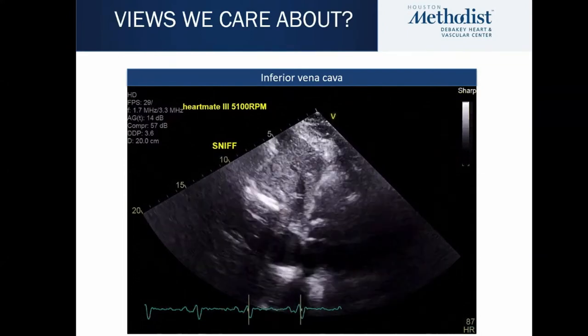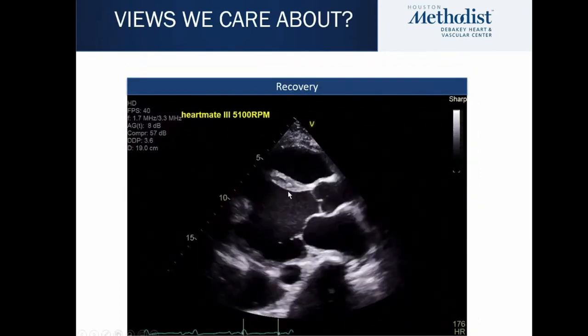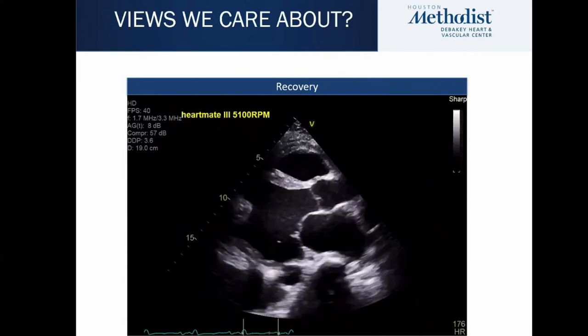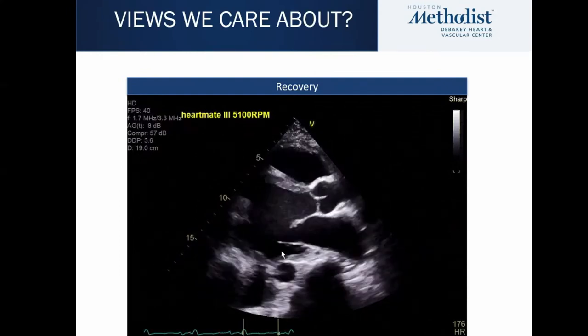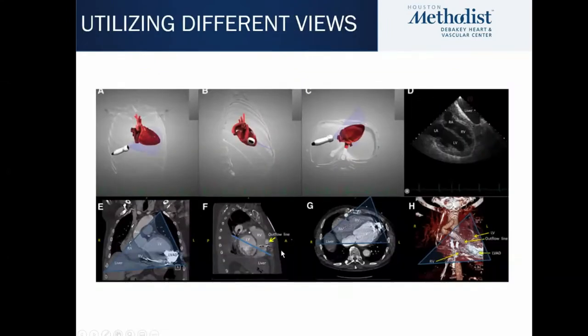Now, again, as I mentioned, it's very important to know the LV function. The prior video that I showed was of a patient where the LV was more robust and was contracting okay. So again, an assessment of LV function is important. This is somebody who has a newer implant and their LV size is dilated. LV function is very, very reduced. Now, often we don't get very good images for patients who have LVAD. For one, I do think it requires a little bit more persistence on the part of the echocardiographer.